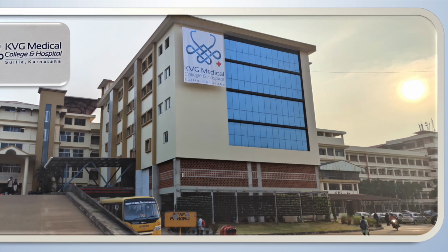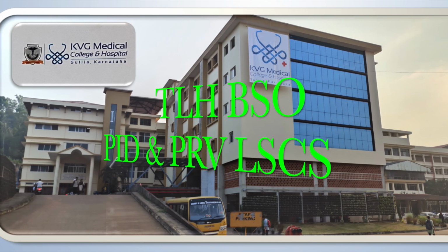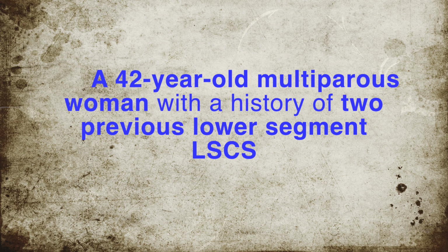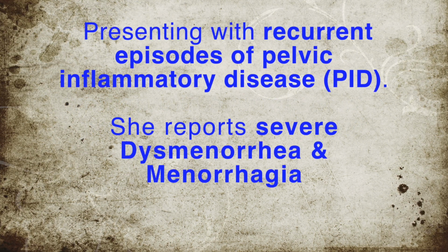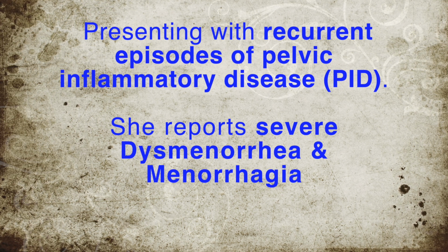Hi, I am presenting a case of total laparoscopic hysterectomy for pelvic inflammatory disease. A 42-year-old multiparous woman, who had a history of two lower segment cesarean sections, had repeated episodes of pelvic inflammatory disease with severe dysmenorrhea and menorrhagia.